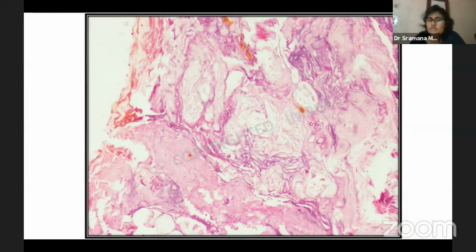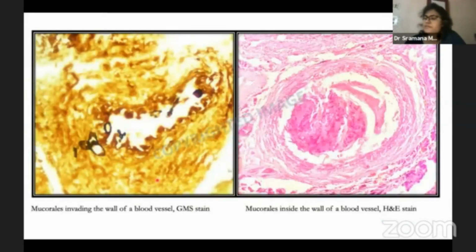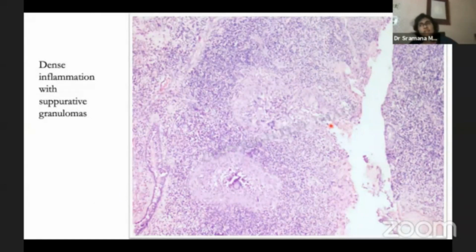This is infarcted tissue, but there are hardly any inflammatory cells, but you can see the twisted, folded hyphae of Mucorales. Angioinvasion is a typical feature of Mucorales. So we can see a vessel wall being invaded, and this is a lot of fungi within the blood vessel lumen causing thrombosis. Now, we saw a spectrum of bland infarction with hardly any inflammation in acute fulminant mucormycosis.